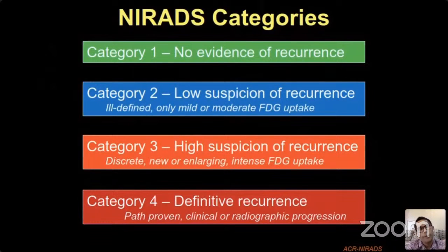Remember, do not perform PET-CT in the early 8 to 12 weeks, because there are chances that there will be inflammation and you will get spurious FDG uptake, which can lead to misdiagnosis. So at 8 weeks, doing an MR with diffusion-weighted study is the gold standard of follow-up imaging. And if there's a doubt, then you can supplement with either direct biopsy or an FDG PET-CT.